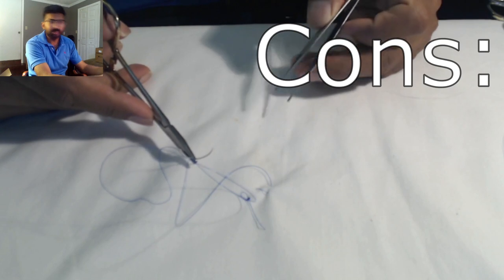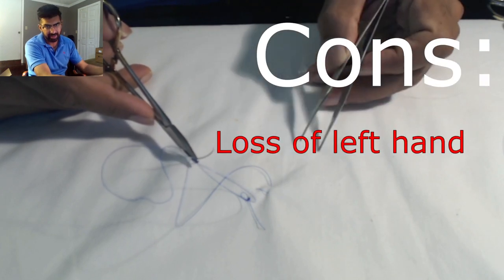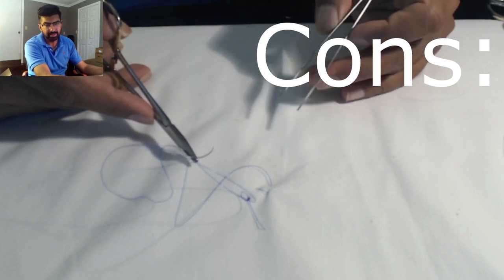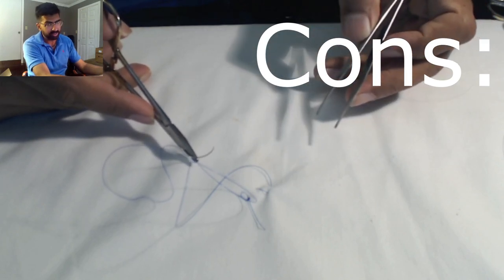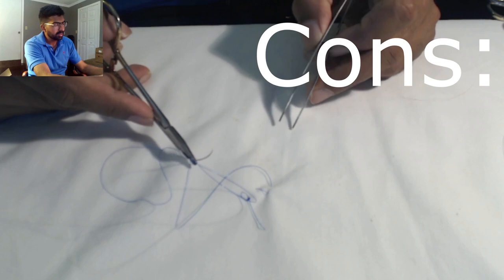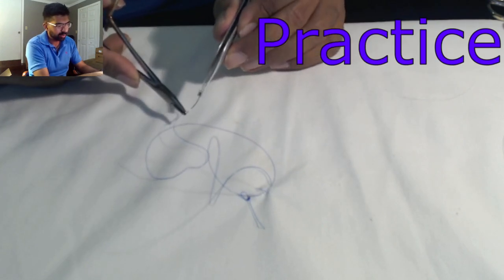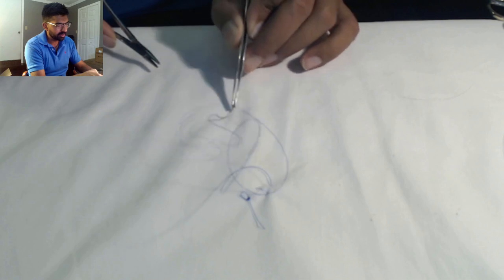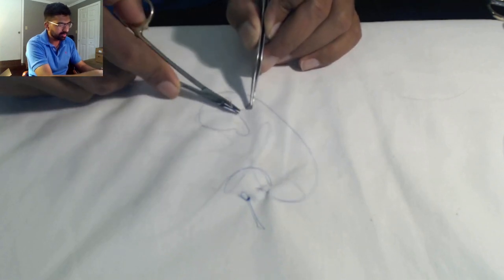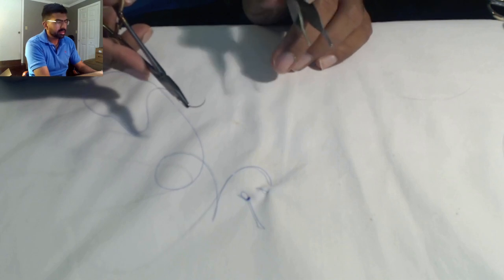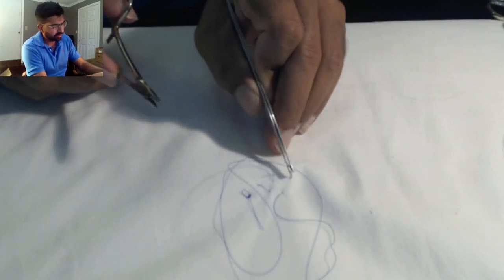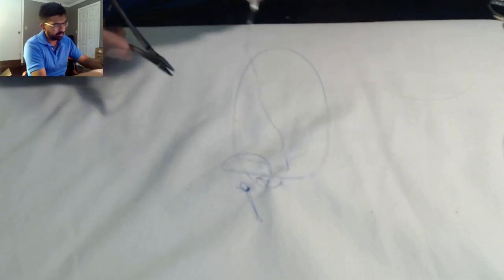The downside is you're using your left hand for something. You're using it to reload, so if you're using your left hand for retraction to show yourself the bite or to hold tissue in place, you lose that ability. The best way to learn this technique is to grab at about 25 percent of the needle, let about 80 to 100 percent sit on a surface, then rotate the needle to whatever angle you need as you reload it. This is a really easy exercise: take the bite, grab the needle, make sure you rotate it out. Once it's out, rest your hands, don't let them float, then reload the needle.